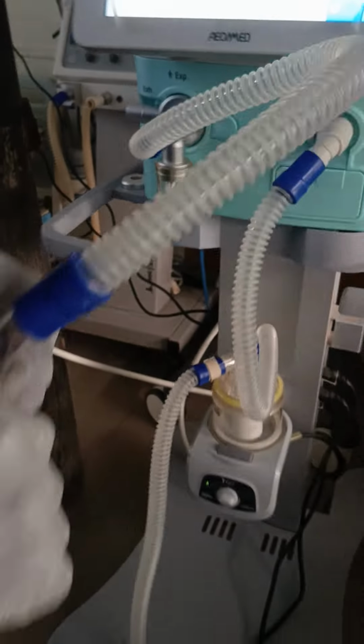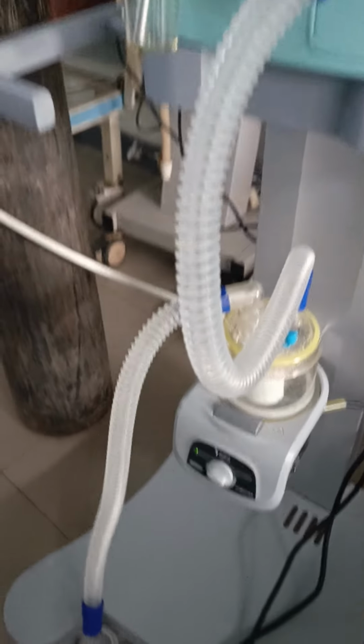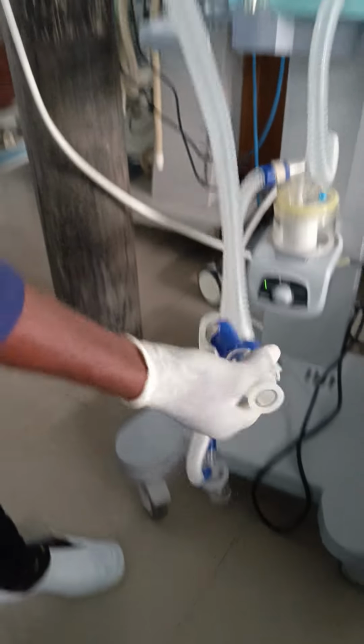The water trap is to assist in trapping any form of fluid, water, from being delivered to the patient.